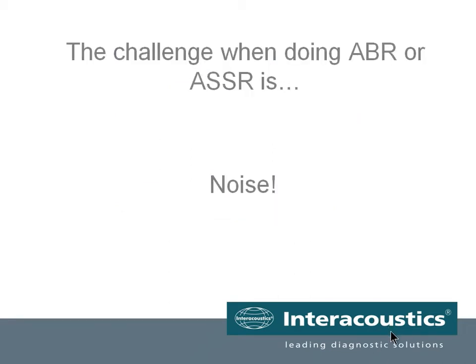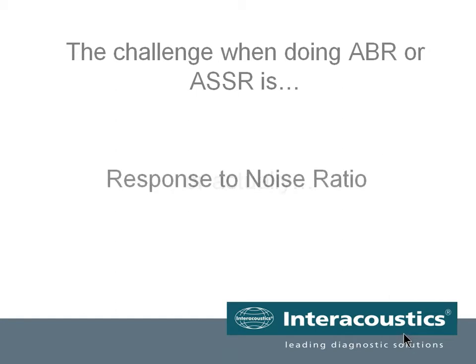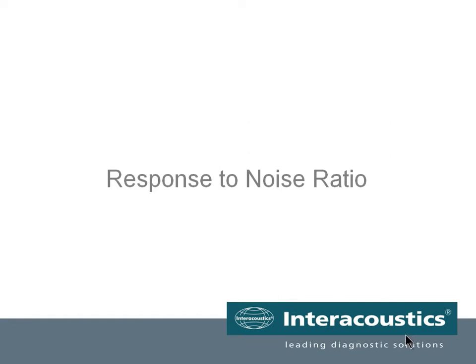When doing ABR or ASSR, we always talk about how noise is really the big challenge. However, the question is if indeed it is the noise that is our problem, or if it is not rather the response to noise ratio.